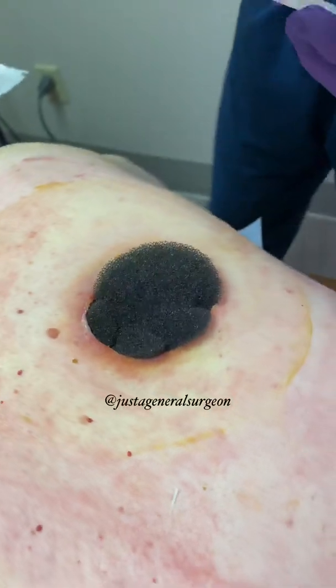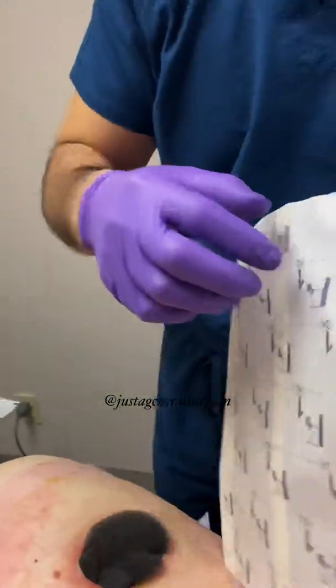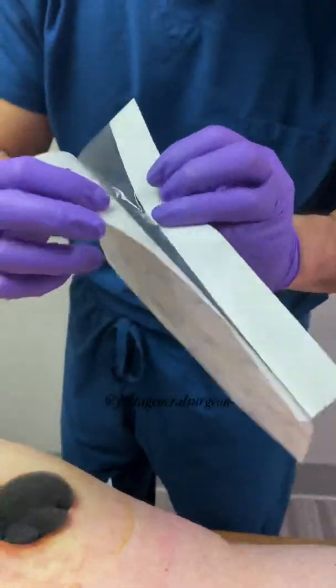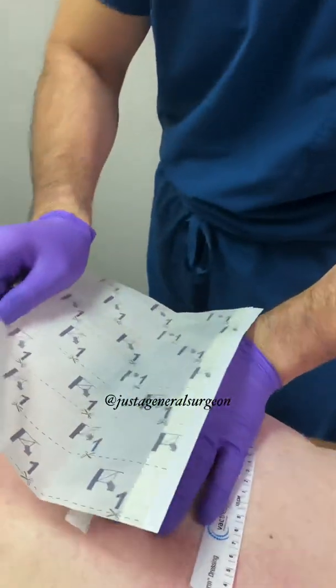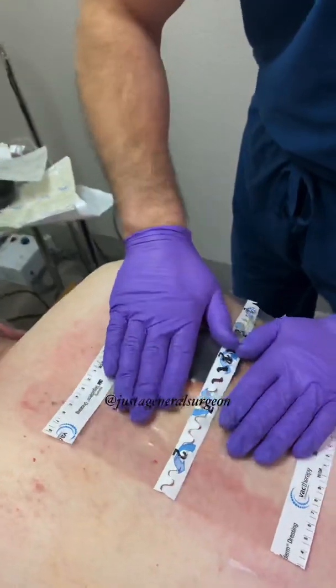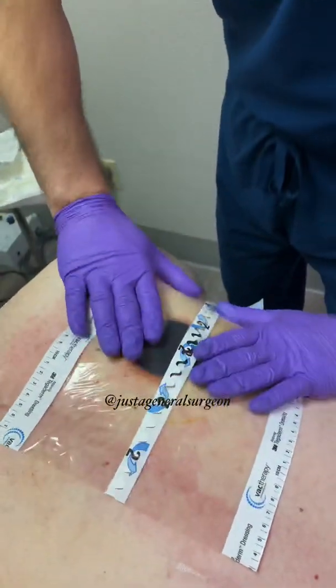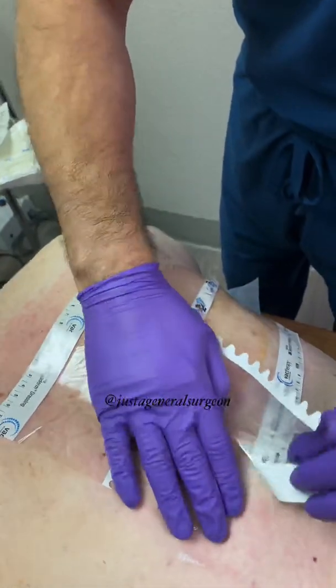That's the worst part, and then on top of that we put this adhesive drape here. It shows you the steps to remove — step number one. Make sure the skin is nice and dry so this thing sticks, and do remove number two.